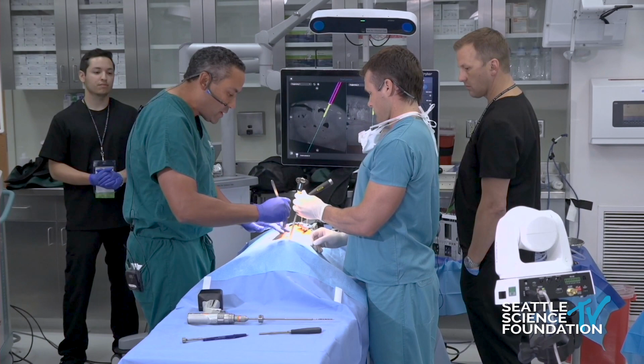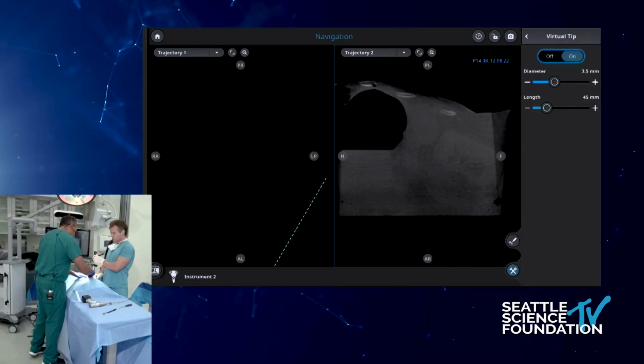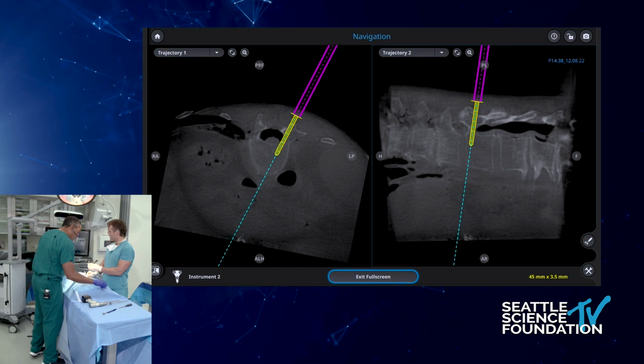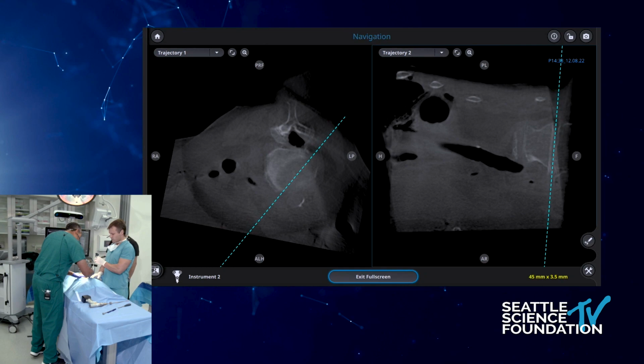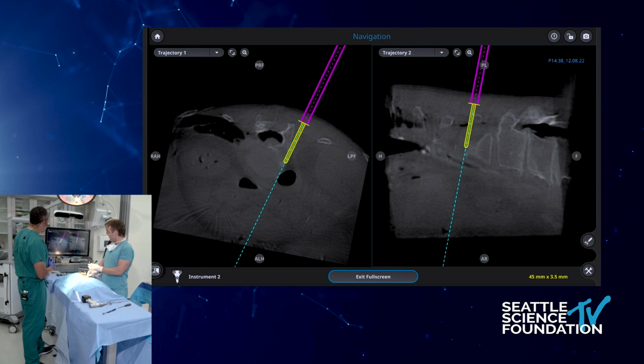And then, nope, you have the correct tool. Okay. Okay, so now you're gonna come back in with that thing. Let me just make that slightly bigger for you. Okay, so come on in. Get through the skin. There you go. Okay, now you're going to dock on bone where you want it to go. So I would be, yep, that's great right there.